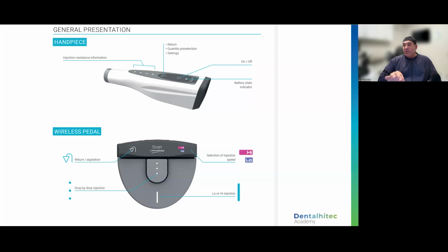I will tell you that for intraosseous delivery, they're going to feel that, right? I've had times where I accidentally hit the button and it was on pink, and patients felt that difference in pressure. So you really need to make sure that this is on blue.